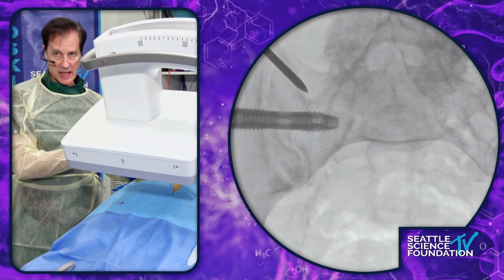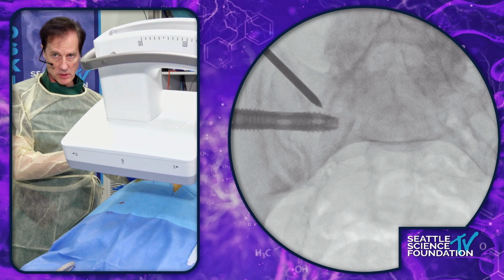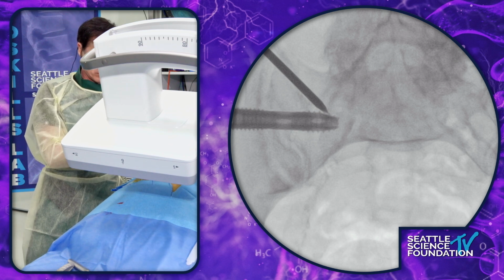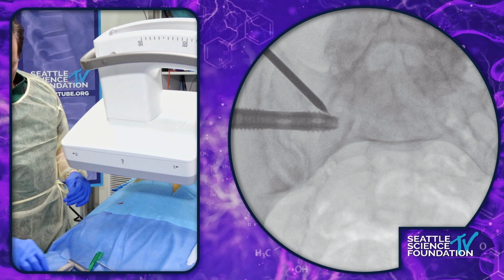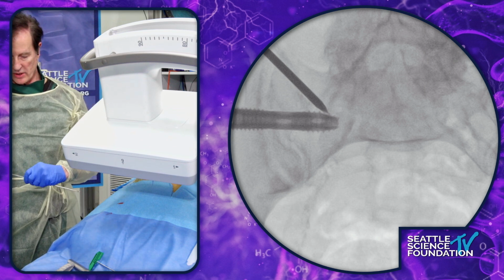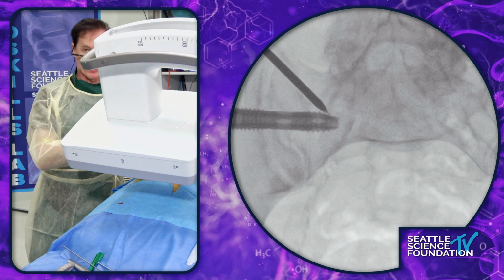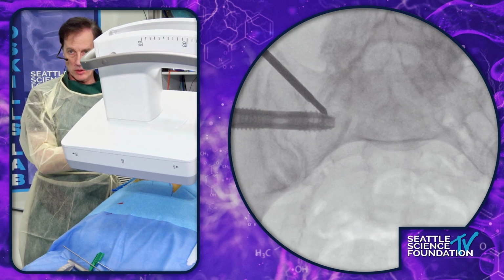And we're coming down, angling right across the joint. Picture that. Good. So I'm going to place the Steinman pin and have the same sequence. So the Steinman pin goes in. Picture that. Good.